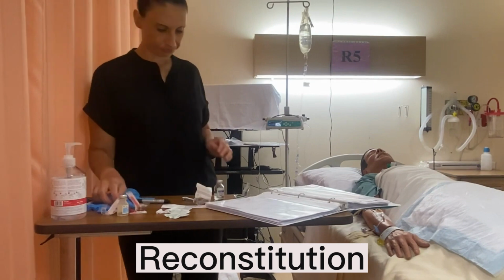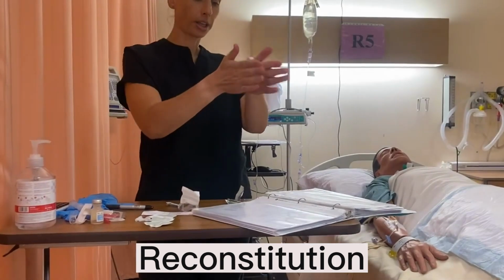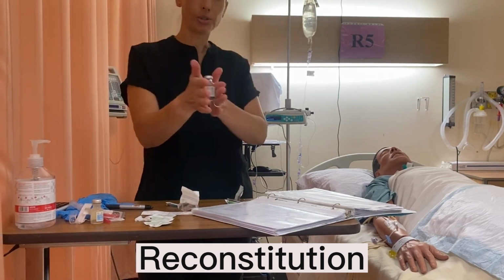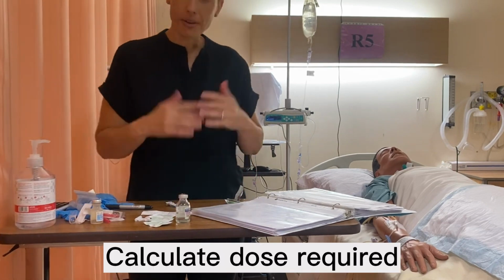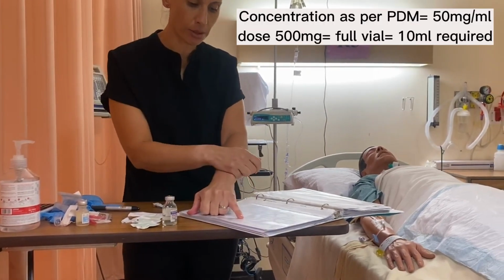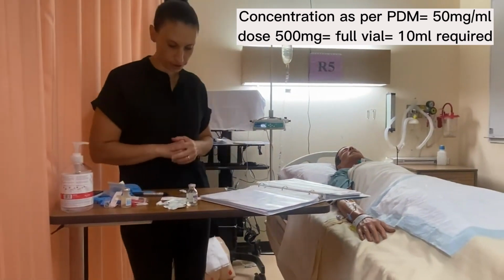scoop and swoop, and then we're gonna rotate that. We're waiting for it to dissolve. Okay. And other things we'd want to check about this vial as well is to make sure that it's not expired. Well, so that we're doing the reconstitution portion. Okay. And then if I needed to do a calculation, I would do my calculation now. So the concentration in this vial, my PDM tells me it's 50 milligrams per ml. I need 500 milligrams, so I'm gonna need the whole vial, the whole 10 mLs, okay?